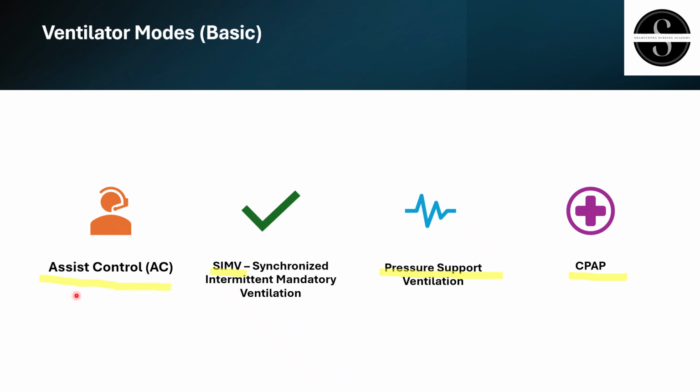Okay, when the patient is hemodynamically stable, we will switch over to the next mode, called SIMV mode. Half the ventilator will take the breath, half the patient will breathe. Pressure support, the patient only will take the breath, only the machine will just support him. CPAP is also similar to pressure support. Clear about the different modes available in ventilator?